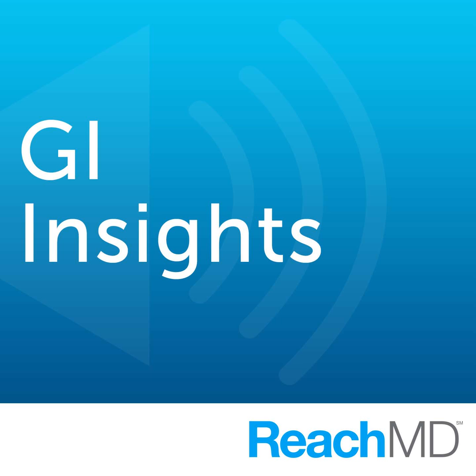One more point, this obviously is different in terms of dealing with overt, massive obscure bleeding versus obscure bleeding that's occult. In massive bleeding, it may not be the right first tool. There are some suggestions that maybe you should go straight to angiography or other modalities. But in most patients, it's the first-line approach.